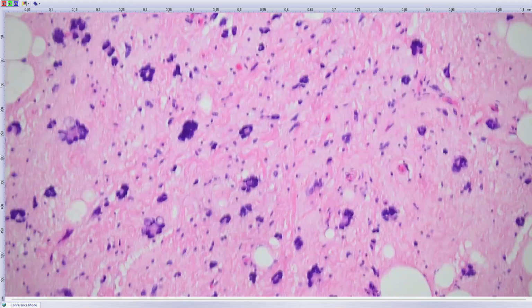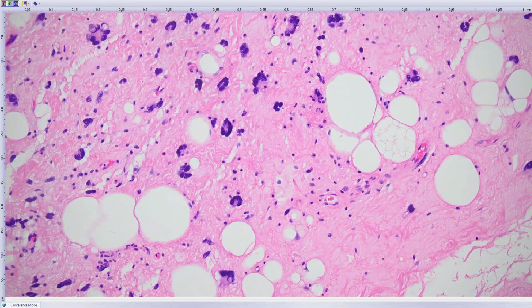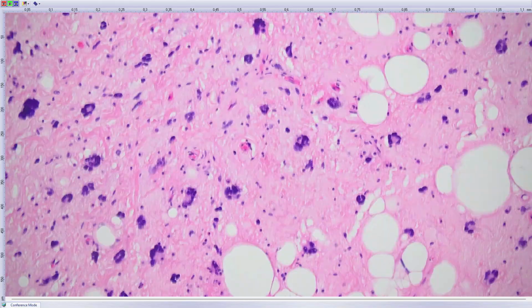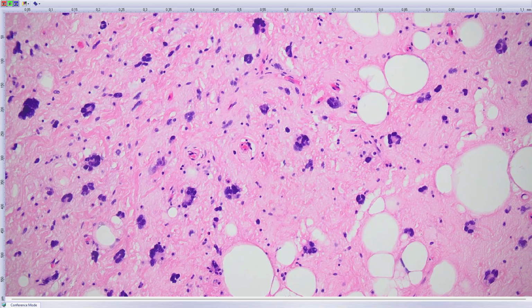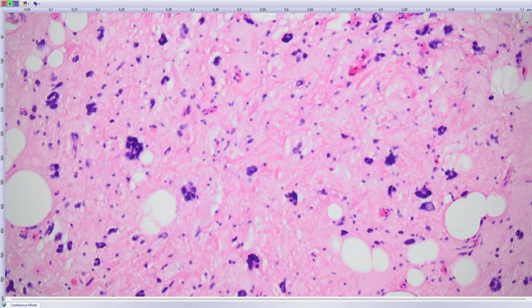And you've got this typical collagen pattern there. And if you search for lipoblasts long enough, you will probably even find some lipoblasts there. On first sight, see everywhere. It depends what kind of cell you call a lipoblast, but yeah, I agree. There are some of these.